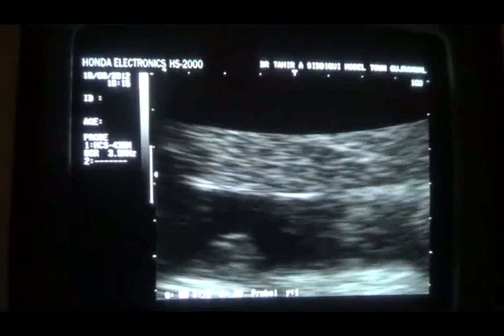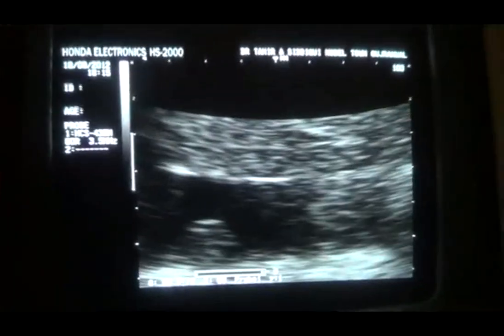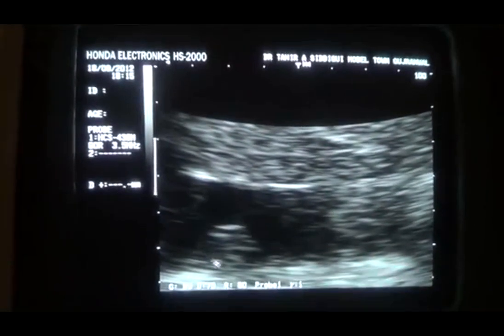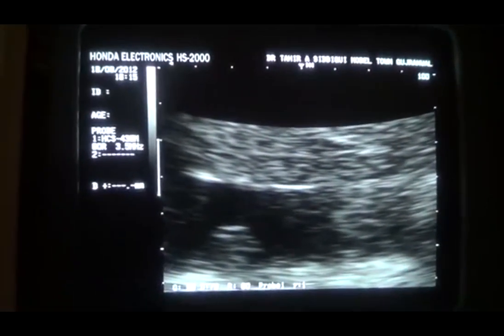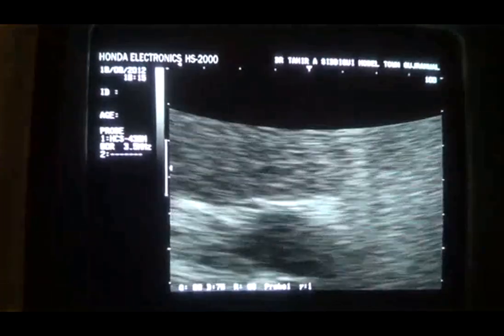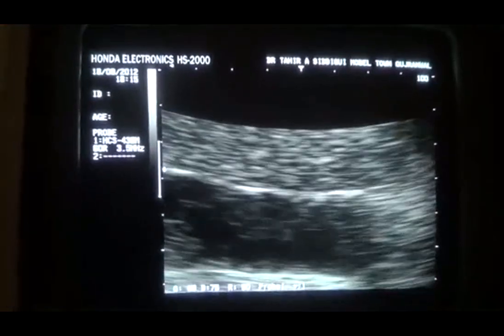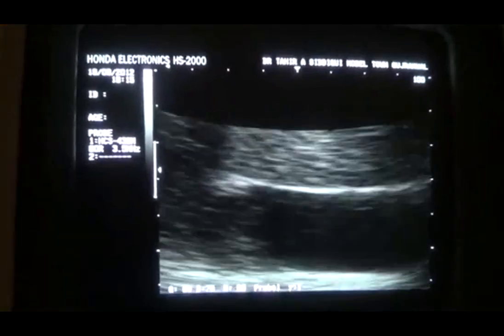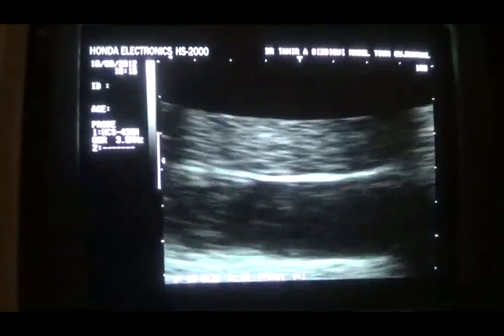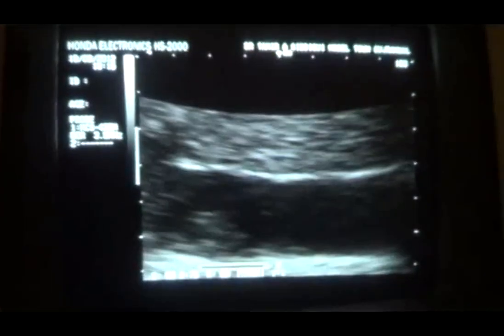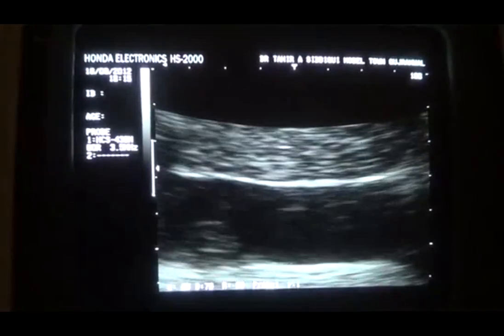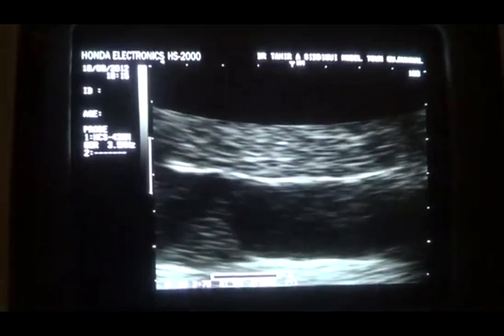You can see that the clot is there. This is the lumen of the inferior vena cava, this is the clot — remember the shape of the clot — and it persists in the same location. This is a short study regarding the clot in the inferior vena cava.